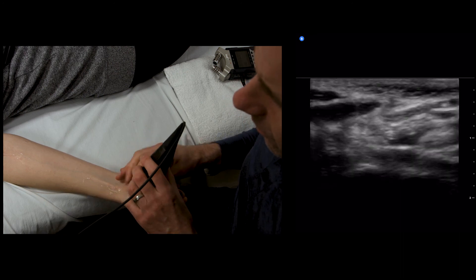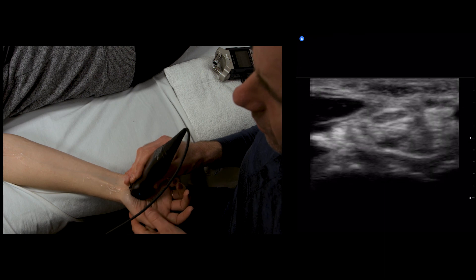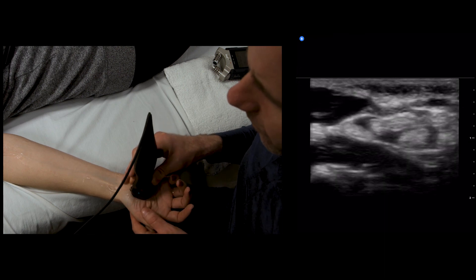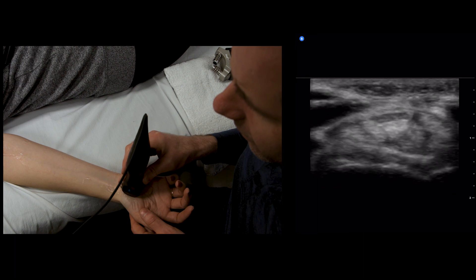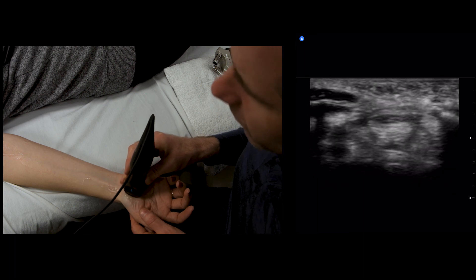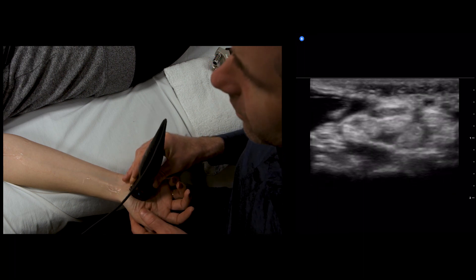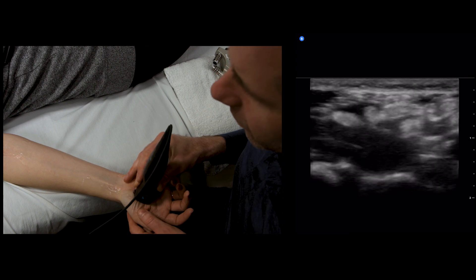If I rotate it here and flex the wrist a little bit, after it exits the carpal tunnel—here's the edge of the carpal tunnel—after we exit, it divides into its digital branches.